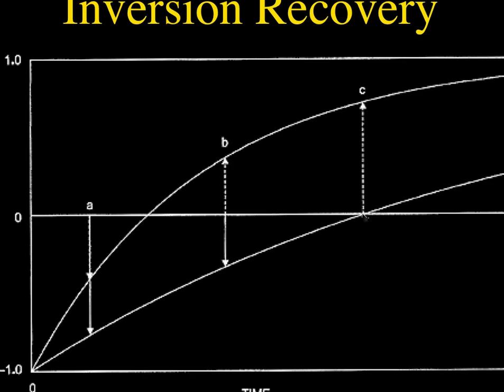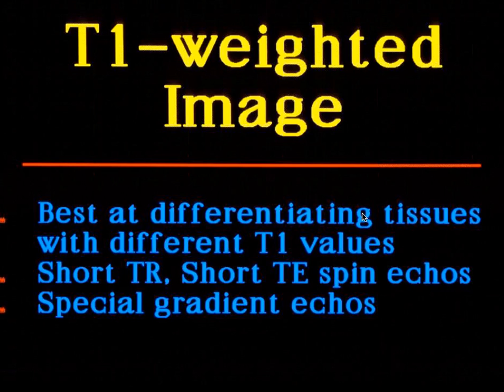That turned out not to be very helpful, but it very rapidly became a useful sequence for bones and soft tissues, really looking for subtle areas of edema. And it gives a combination of T1 and T2 contrast, which, as we know, is very sensitive for pathologic conditions. So that's inversion recovery sequences.